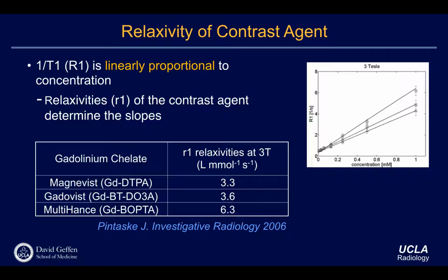Yeah, so that's a great question. The main change will be whether the contrast agent goes into the intracellular space or not. In most cases, it doesn't really go into the intracellular space. Then it's actually pretty much the same, like a free solution situation. But if the contrast agent goes into the intracellular space, then things are quite tricky.